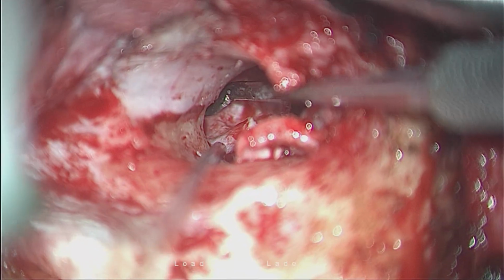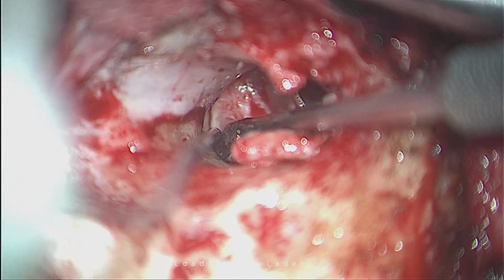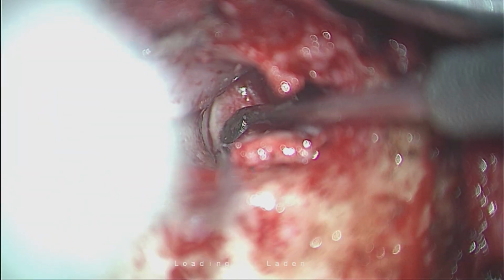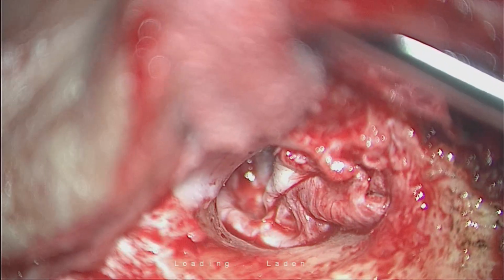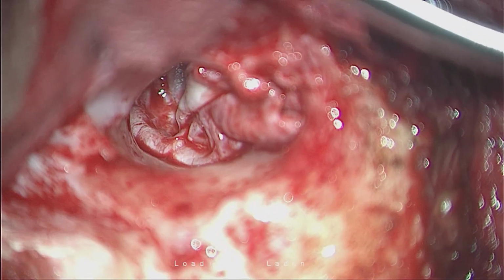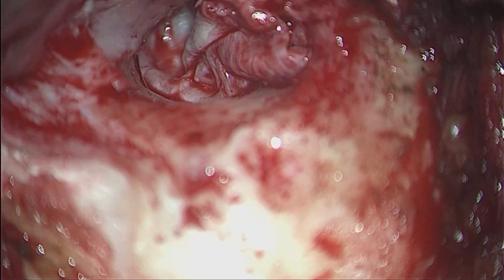See, now I am coming inferiorly. Goal is to reach the level of the annulus all around. And now posteriorly. Feel free to interrupt me. Yeah, it's going well, Satish.